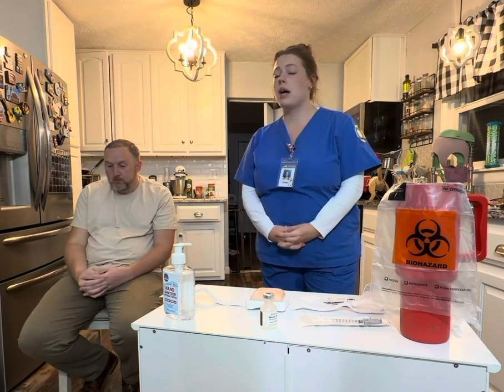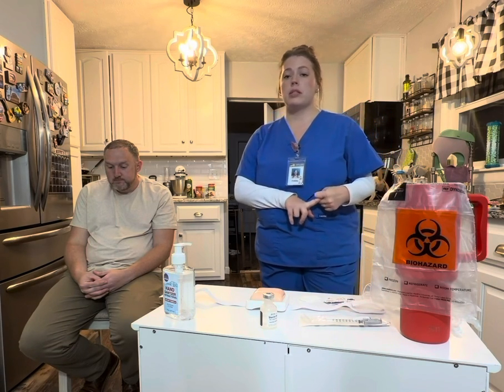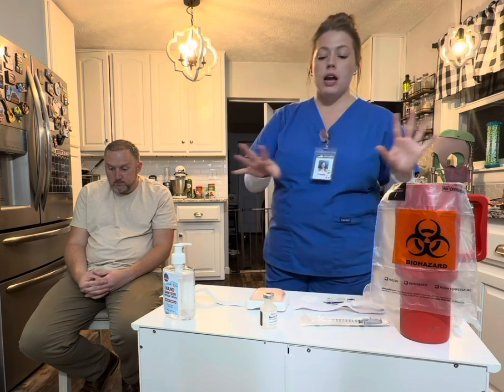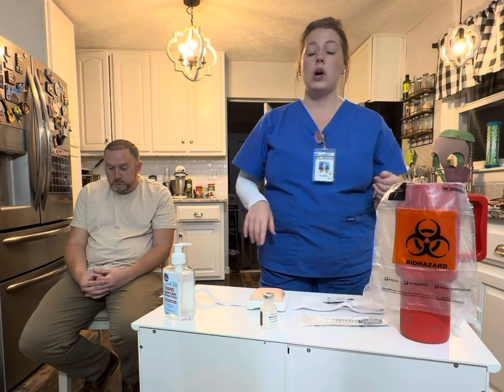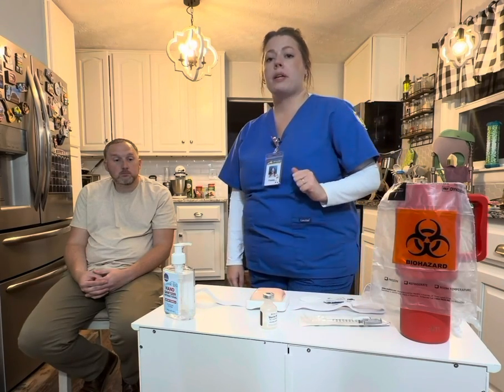Hello, my name is Paisley Robinson and I'm going to be demonstrating my subcutaneous injection technique video. I'm going to make sure that I follow my general principles and safety practices along with my 11 rights and my 3 checks. I'm also going to make sure that I have all my equipment gathered along with verifying all the orders. So first I will go ahead and knock on my patient's door.